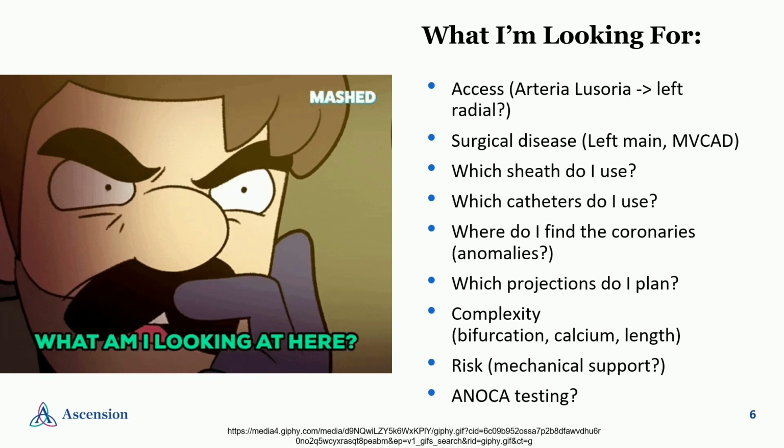And then for patients who come to me with angina or symptoms that are potentially anginal, even if the CTA is normal or negative, doesn't mean that we don't proceed to invasive coronary angiography, because potentially that patient needs to be tested for the angina with non-obstructive coronary disease, patients with coronary vasospasm, with microvascular dysfunction, with bridges, that we can now test invasively, modify therapies, and improve outcomes for those patients just by giving the diagnosis, not to mention the specific treatments that we have available.